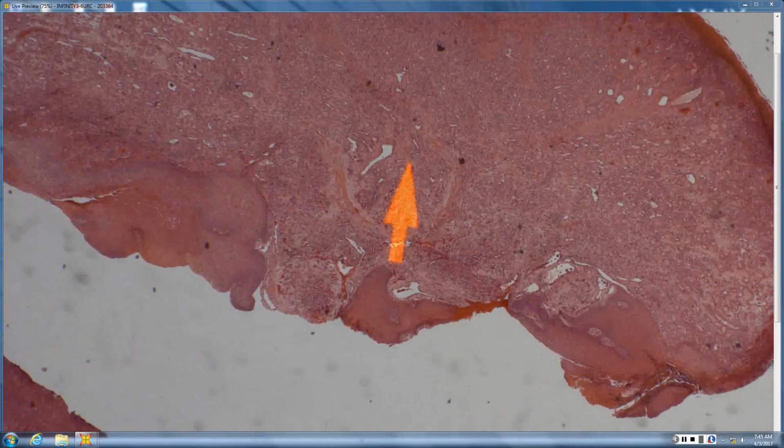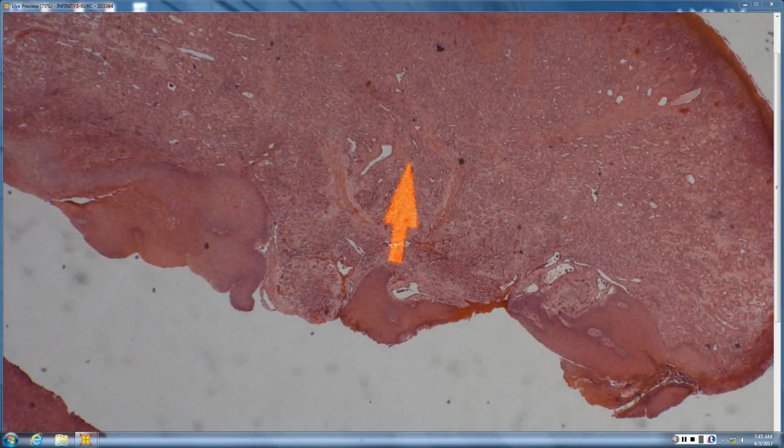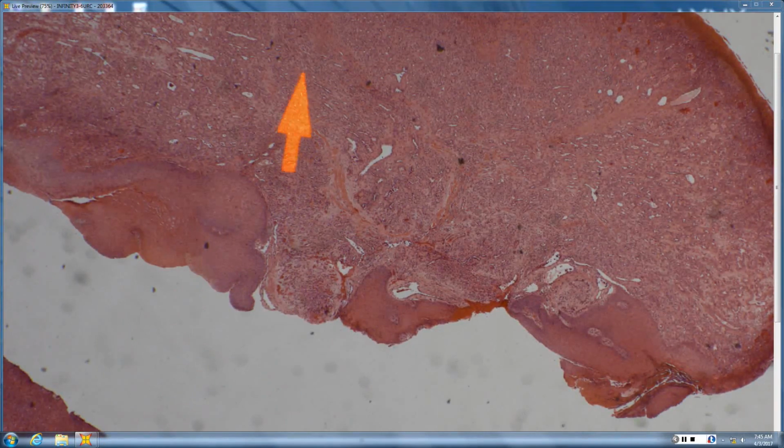Pretty dense dermal proliferation, kind of a central dilated vessel. So if that's epidermis, do you think this is an endophytic or exophytic thing? Exophytic. So exophytic, and is the surface intact or crusted? Crusted. And you commented on a central dilated vessel, and then what are all of these connective tissue things dividing it into lobules? Fibrous septi, there's one here. It's like a pyogenic granuloma.